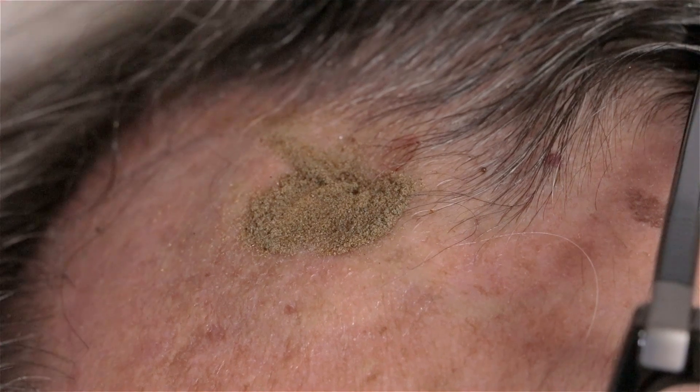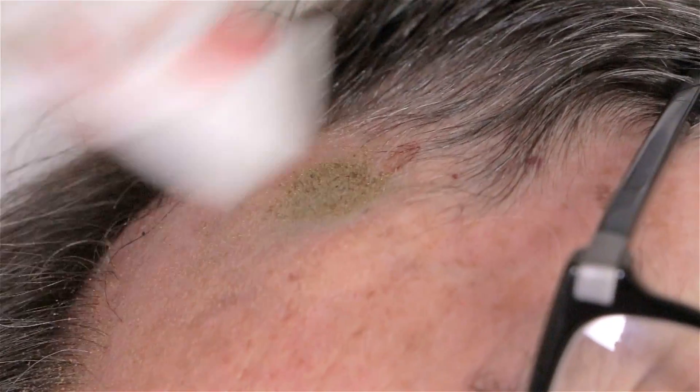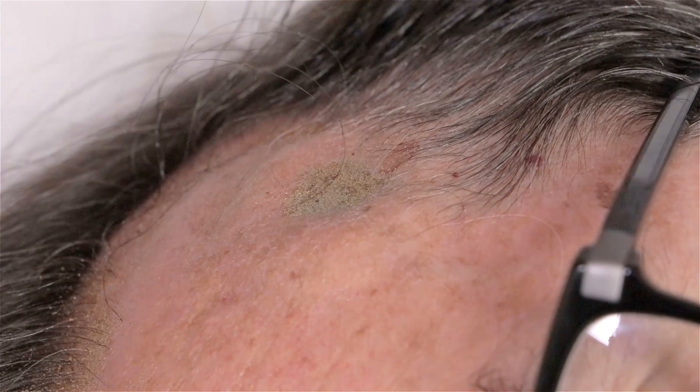So I'm going to brush. Is it okay if I brush it off in this direction? Yeah. Brush off the extra. And then what we'll have you do is carefully sit upright. I hope it wasn't too horrible to go through. It really wasn't too horrible. Your job was the easiest one. It was easy.